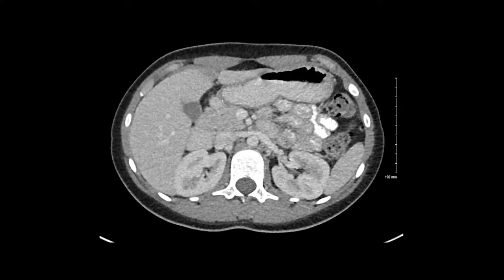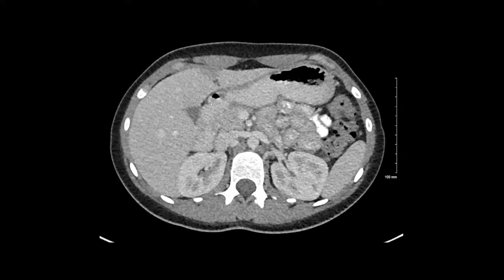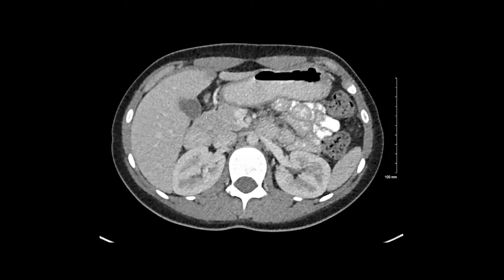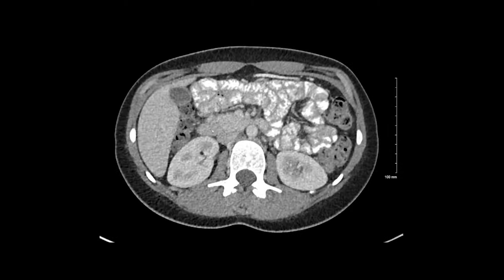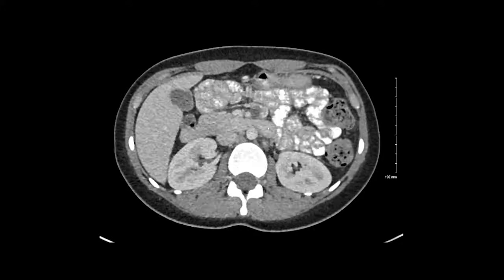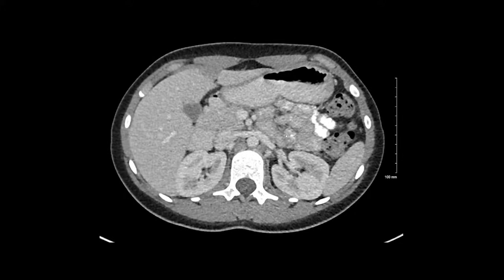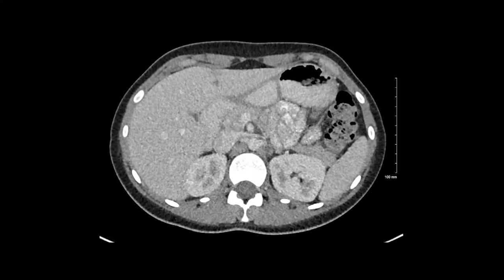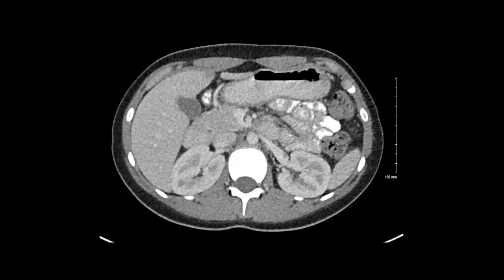We go to the antrum, the pylorus. This is a little bit of gas within the duodenal bulb. In this particular patient, they were administered oral contrast. Most of that oral contrast has actually passed beyond the upper GI tract into the small bowel.